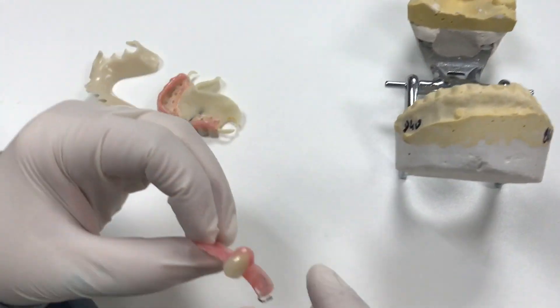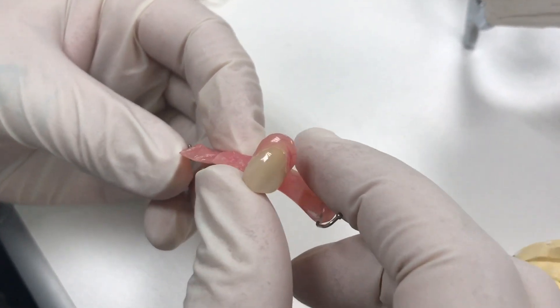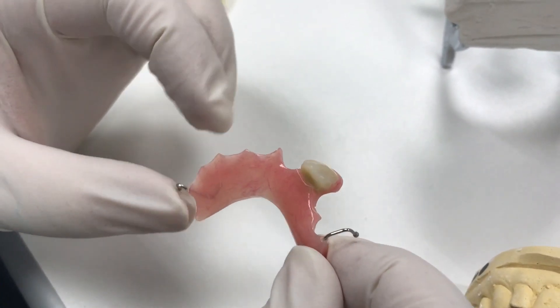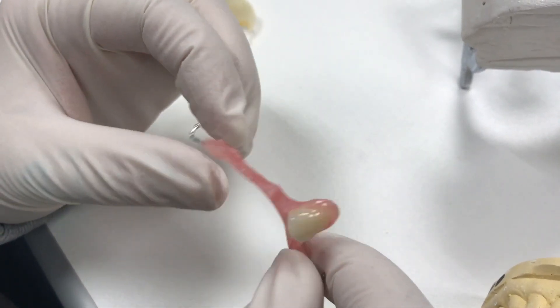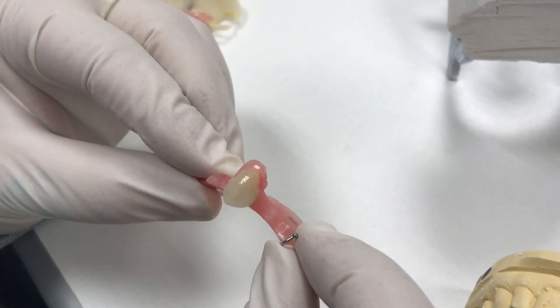We have an acrylic one-tooth flipper. A lot of people like to call them flippers or temporaries. It's all hard acrylic with a processed denture tooth, and we always put two clasps on ours unless the doctor indicates no clasping on the RX. We always like to include a little retention, and they can always cut it off chairside if they don't need it or it doesn't work out for them.